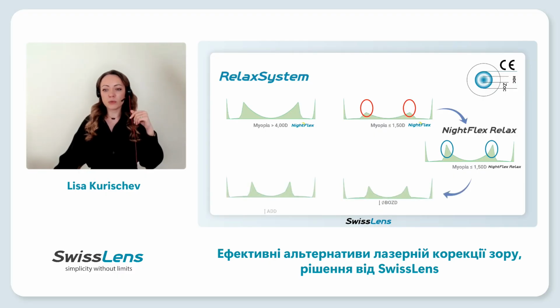So the option is very helpful, not only for children, but also for patients who still have increasing myopia, such as the case from Victor.